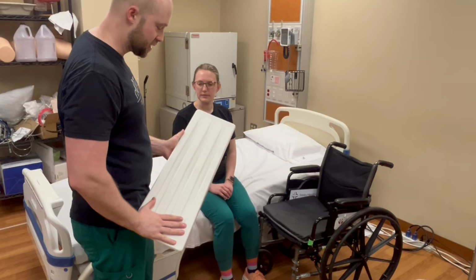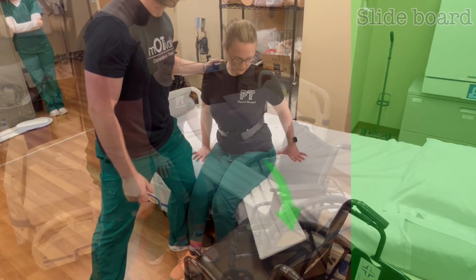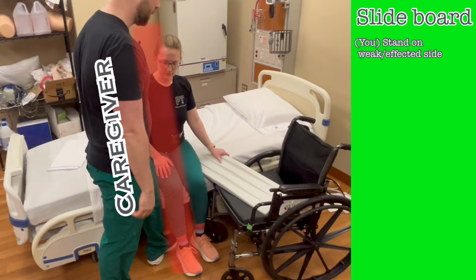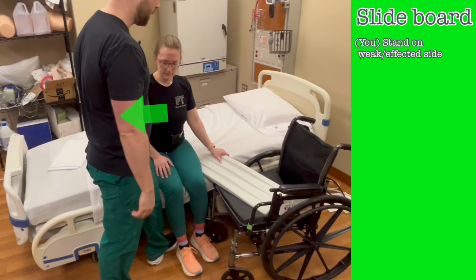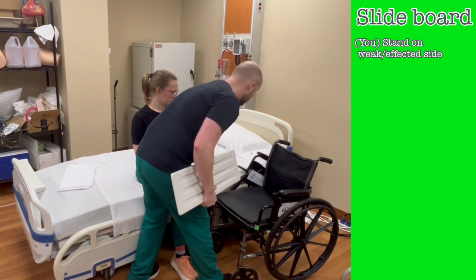You'll need a slide board like this one shown here. They are sometimes made of wood, and they sometimes have handholds cut out of the sides, but they are always long boards that will bridge the distance from one surface to another for the patient to slide on as they transfer to a new destination. As the caregiver, position yourself on the weak or amputated side. If the patient is going to fall, it will be toward this side, so position yourself to protect the patient and prevent the fall. Remove the armrest of the wheelchair if possible.